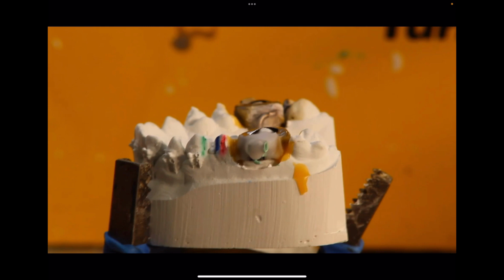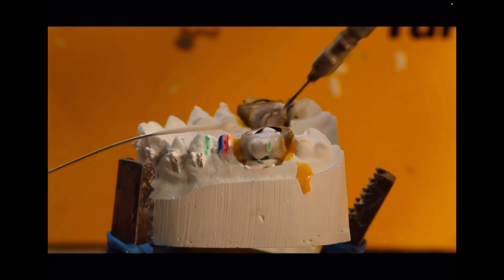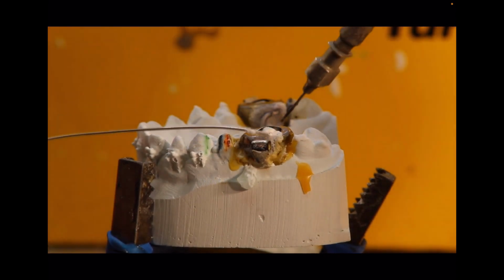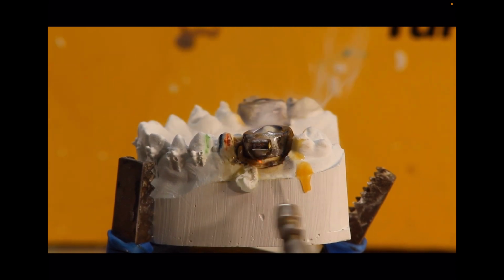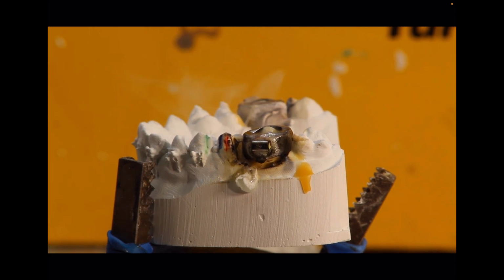Next, we're going to go into soldering. We're using a hydro torch. This is a really good method of soldering. I highly recommend that you purchase one of these if you don't have one already. If you notice here, he'll often get the solder started, smooth out the solder a little bit, and then let the solder cool down and become hard so that you can build it up and stack that solder on there. So he definitely utilizes a cooling process in order to stack the solder up nice and smooth.